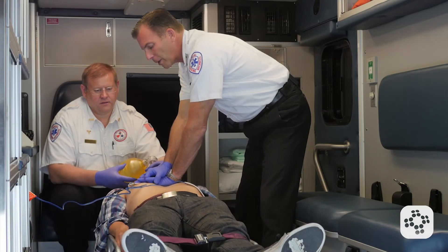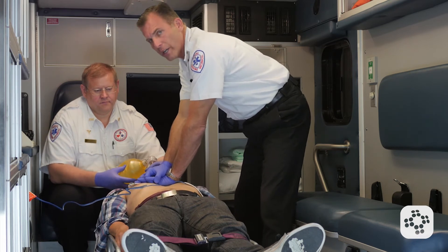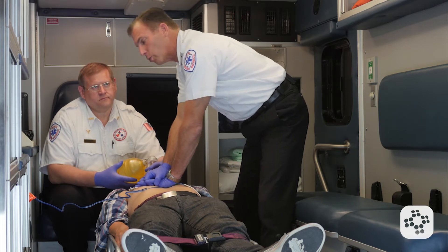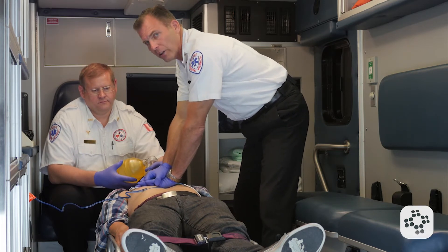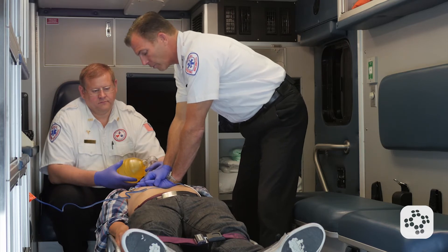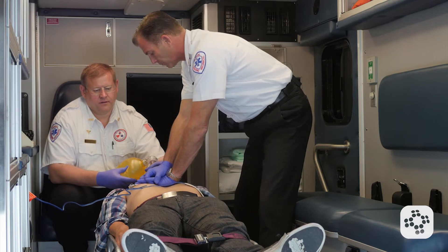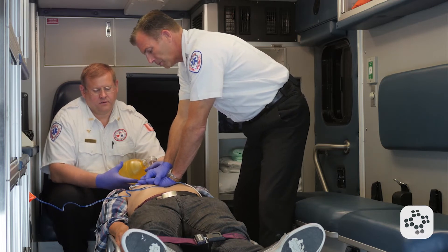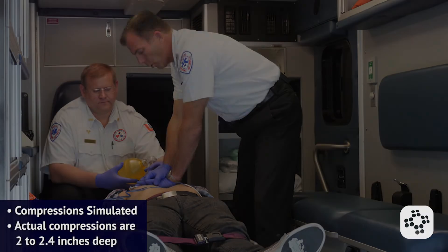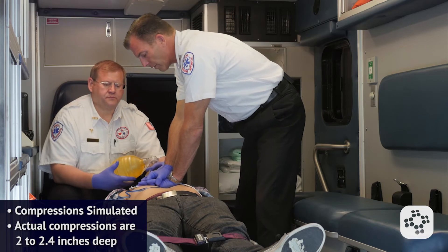Now keep in mind that by the time the AED reanalyzes, it'll be approximately two minutes, which is the ideal time for the compressor to switch with the person who's been giving rescue breaths so that we can have a fresh compressor on the chest. Continuing the count through 30, followed by two breaths. Good breaths. Then back into compressions — continuing until the AED is ready to reanalyze.